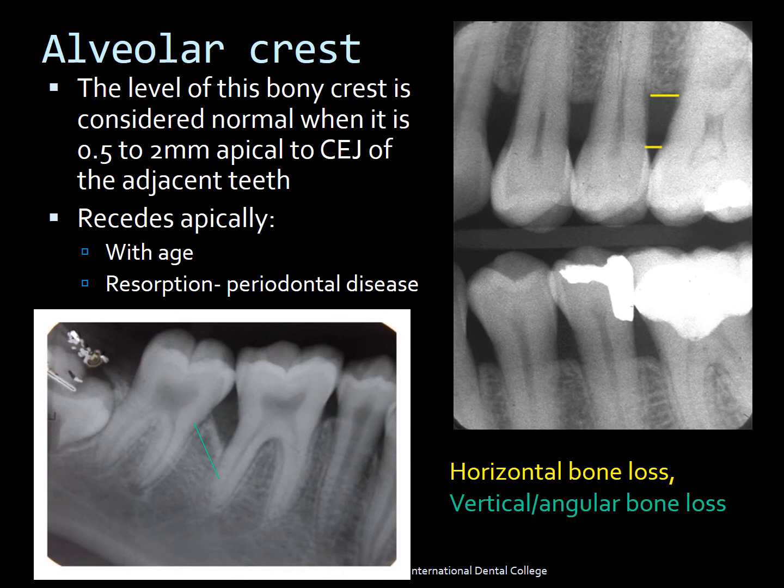Recession or receding of the alveolar crest generally happens with age and also when there is resorption in the case of periodontal disease. The molar radiograph here indicates vertical or angular bone loss — when the bone is lost at an angle, this is called vertical or angular bone loss. These radiographs help you differentiate between horizontal bone loss and vertical bone loss.